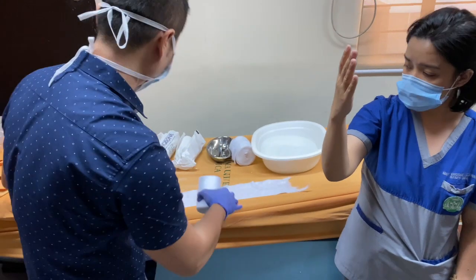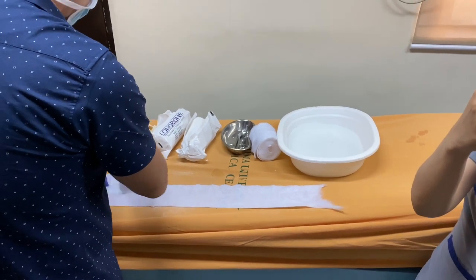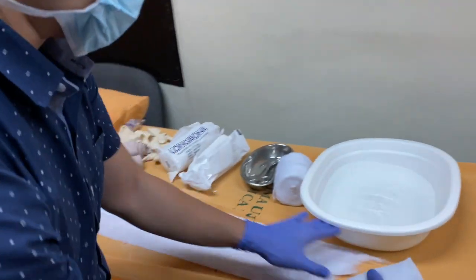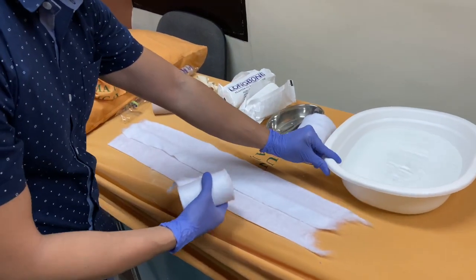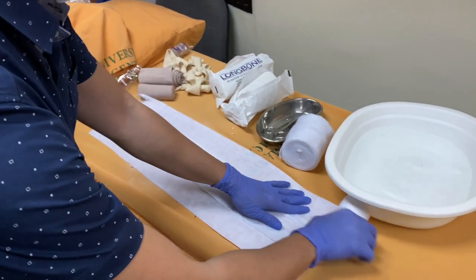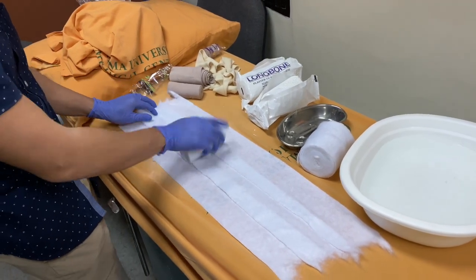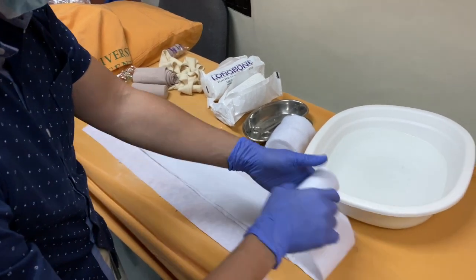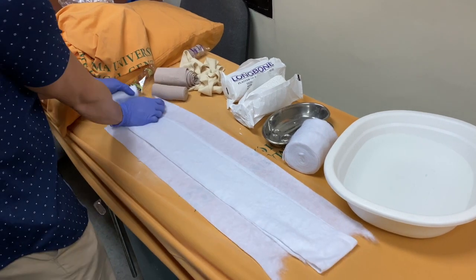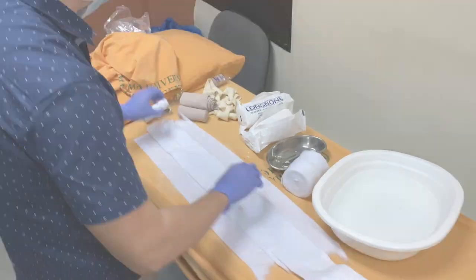This is how I make the splint. Lay down the padding sheet — I add another layer or roll of the padding sheet. One, two — so three layers. Then add another one in the middle, and fold it back. This will be the layer for the other side of the splint. We'll lay down our splint or mold here in the middle.